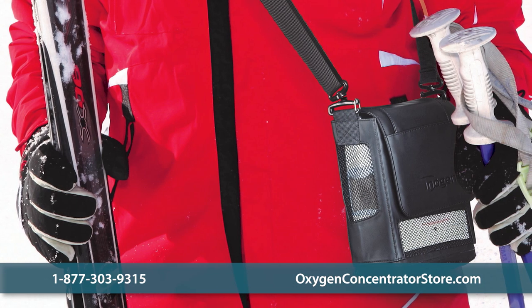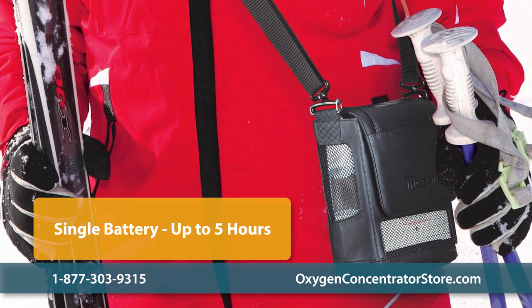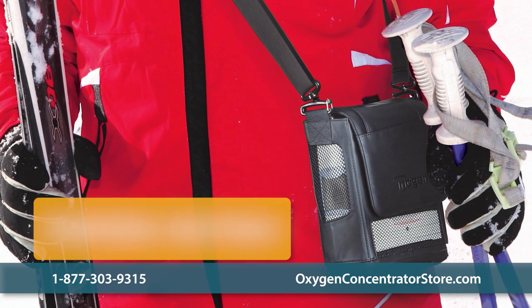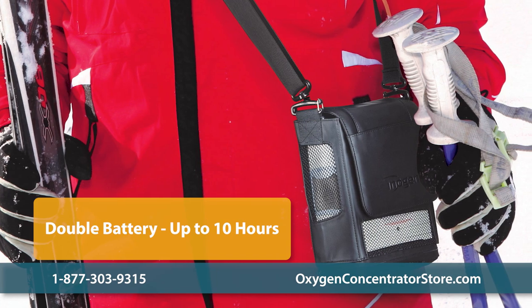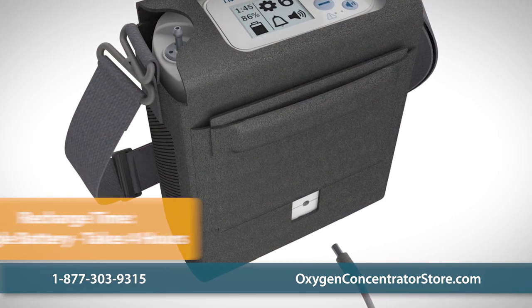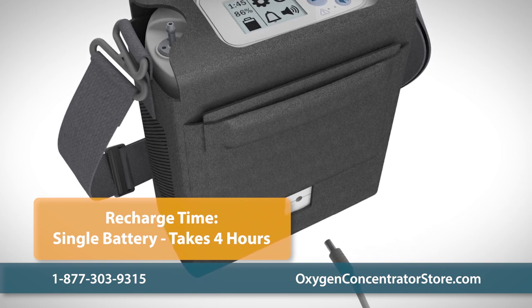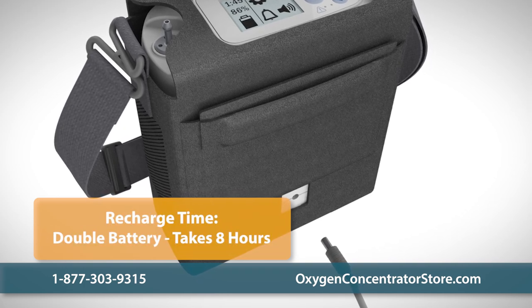The unit is designed for active use and features a long-lasting battery. The single battery can last up to five hours and the double battery can last up to 10 hours on a setting of two. The batteries also feature a faster-than-average recharge time, with small batteries recharging in around four hours and large batteries recharging in eight.